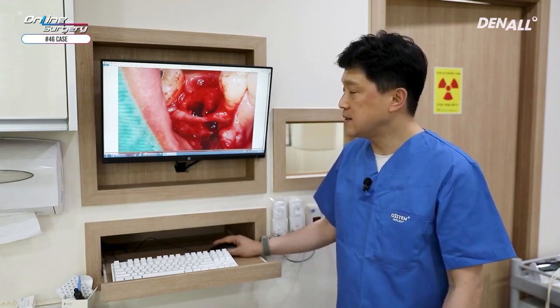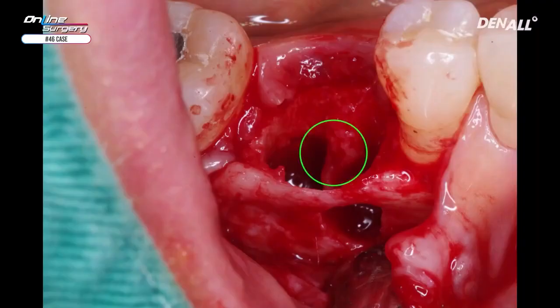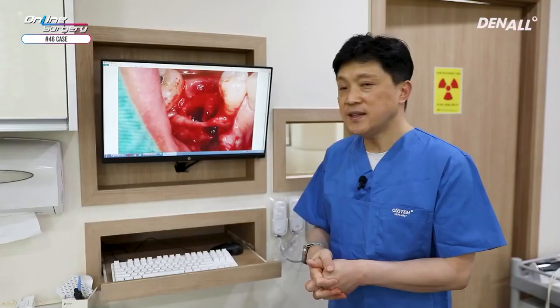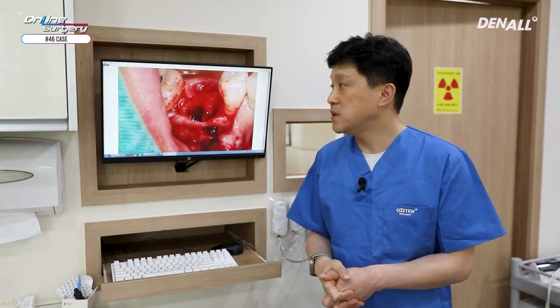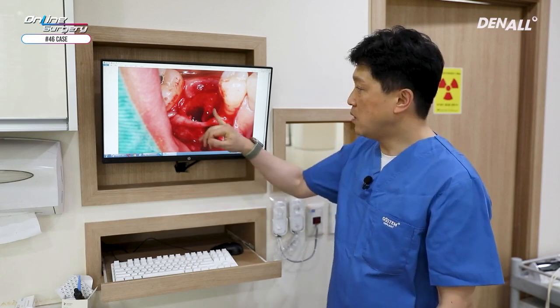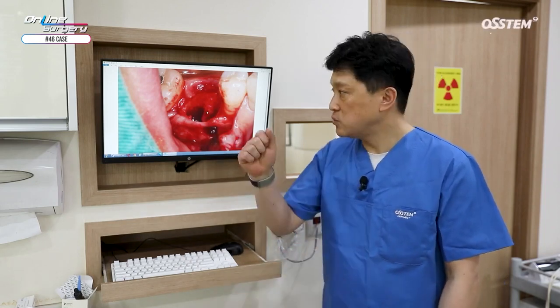It's very difficult to use a guide drill like that. Carbide round burr can be displaced in this case, so it's difficult to use, and in order to prevent displacement, you can use low-speed round burr like diamond round burr. At initial drilling point, you give indentation, and then you do vertical drilling. You can minimize drill displacement in this way.